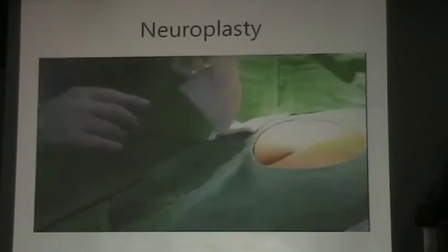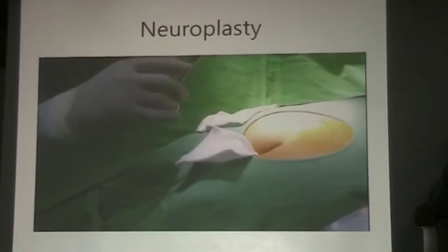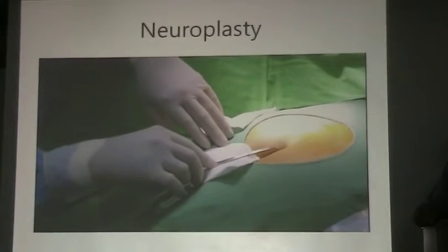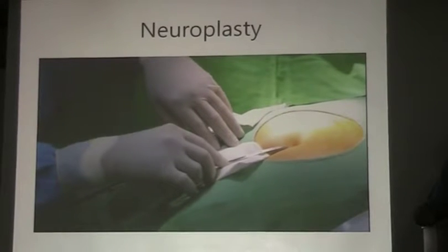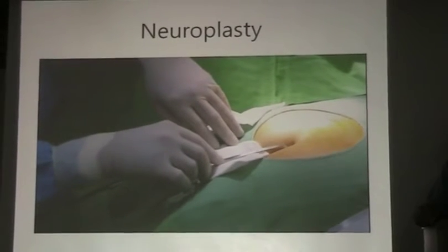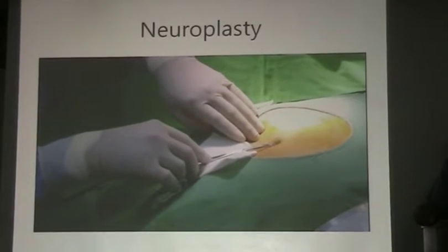This is the preparation of epiduroplasty. Make the entry point, transcaudal approach. Check the sacral hiatus laterally.